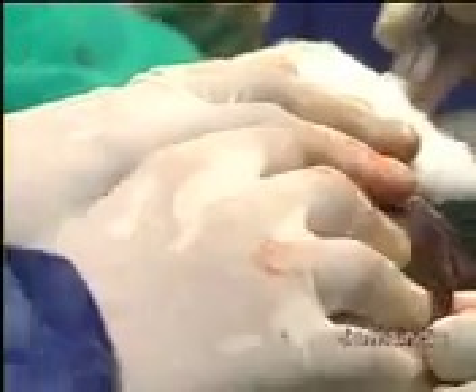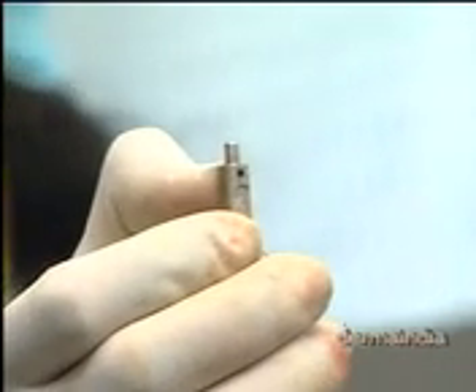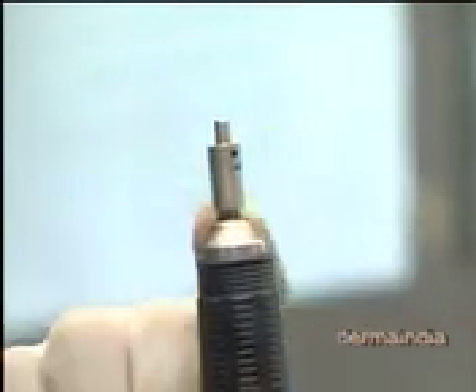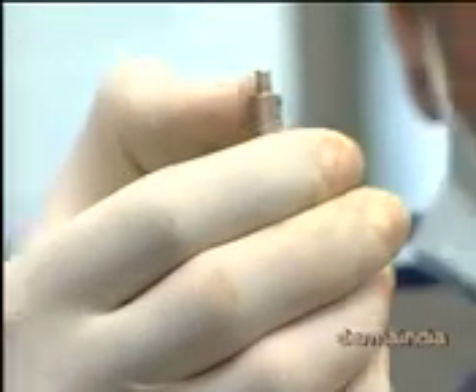No sir, I will show you. There is a guarded thing. See that? Beyond that you can't go. Are you able to see that? So all motor punches, whether it is 1mm, 2mm, 3mm, 4mm, 5mm, everything comes with that guard.